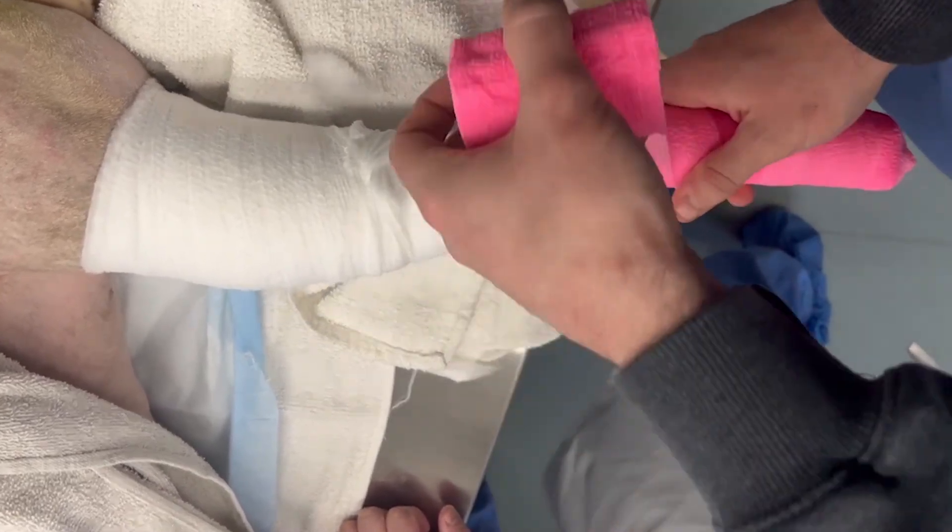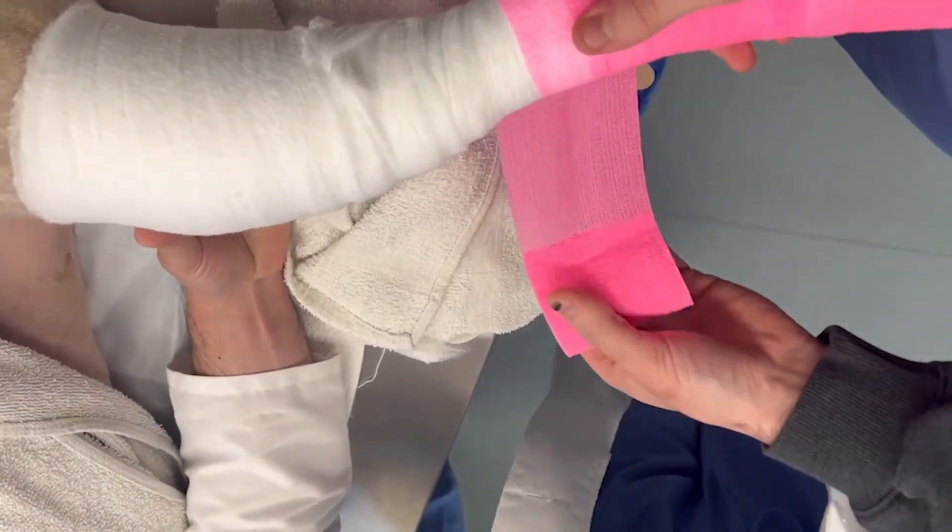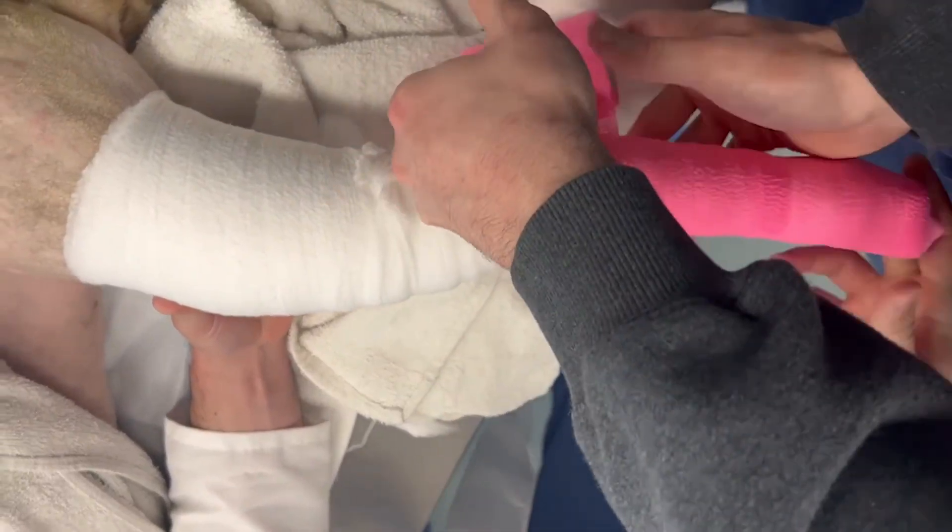It is important to keep the toes exposed throughout bandaging so that owners can monitor swelling and make sure that the bandage has not slipped once the patient has been discharged. If strikethrough is noticed on a bandage, it should be changed immediately.